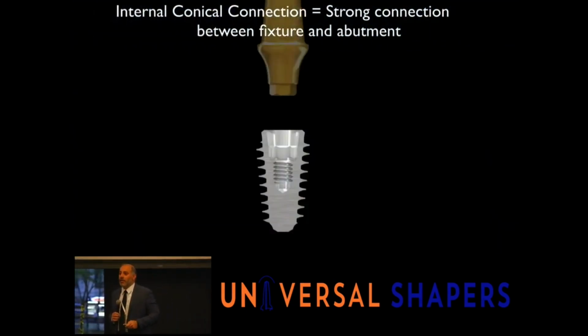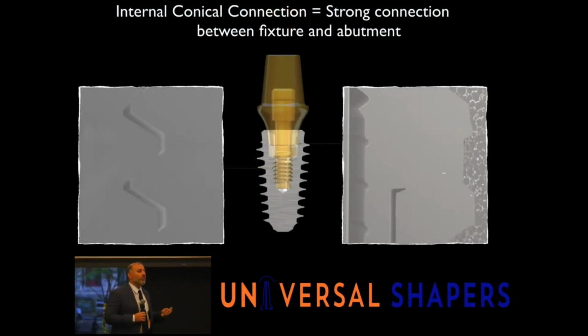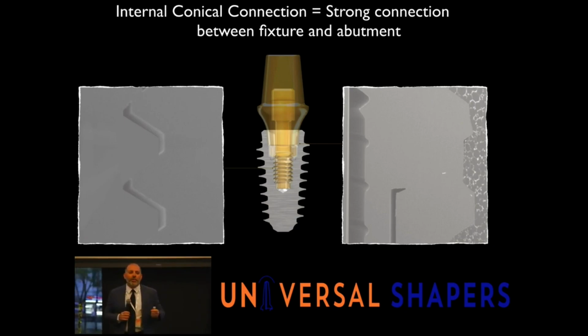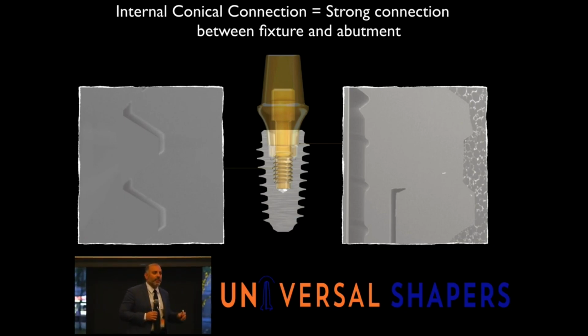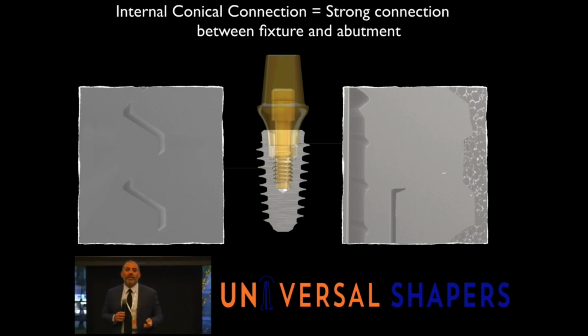But having these conical connected structures, with the ability to block bacteria from the internal surface and not create a house for bacteria to live in, certainly does reduce it. And having a great connection that basically won't just dislodge. It's not like you can go over and bang the abutment to knock it loose. It's got to be stronger than that. It's got to be really wedged in, where you need some type of removal tool to press against it to remove it. That's when you know you have a really solid, good connection.